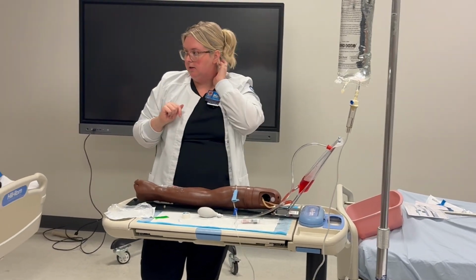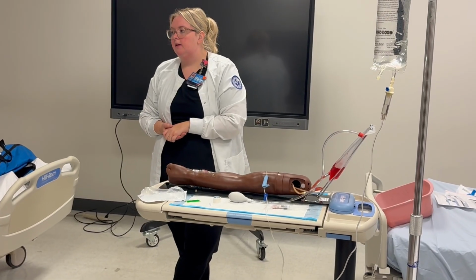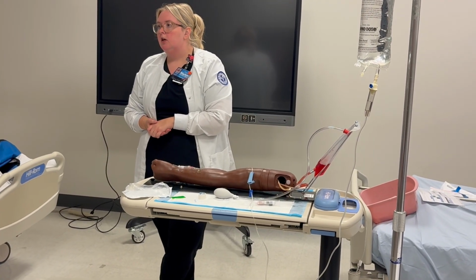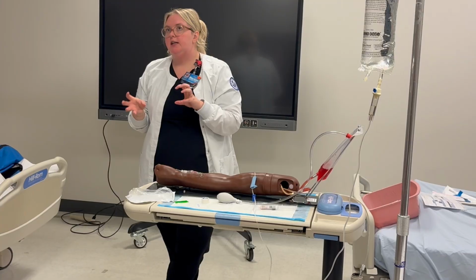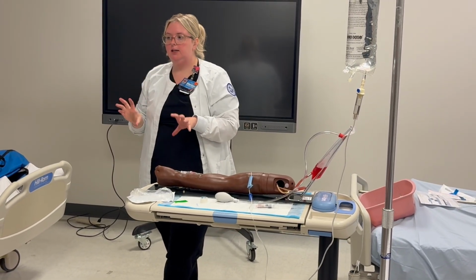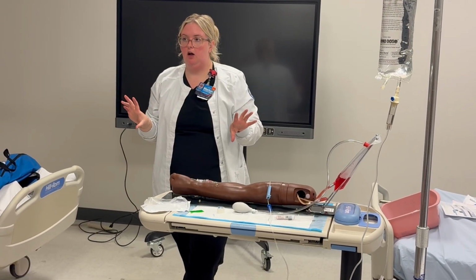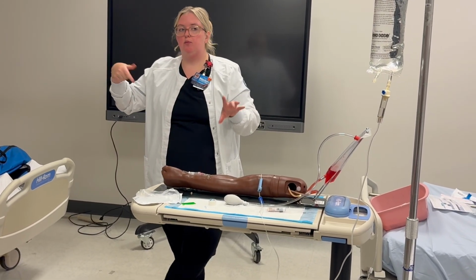I have a question. Yes. So if it's dripping by gravity, what is the standard drops per minute? So there's standards for the tubing. The tubing has a drop factor on it, and we're getting into dosage, so I don't want to overwhelm you guys. You don't have to do any dosage calculation for your checkoff. I'm just showing that for when you get to that point.